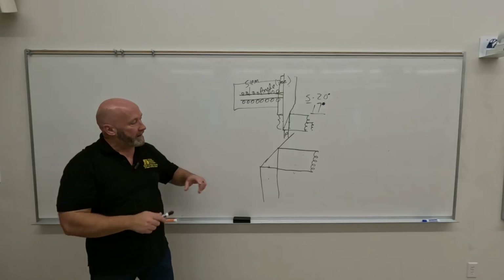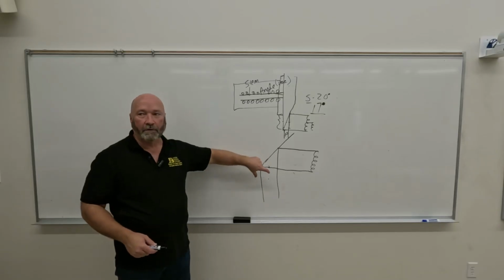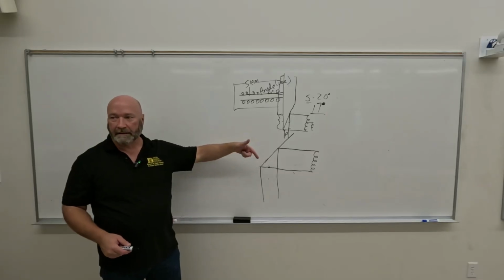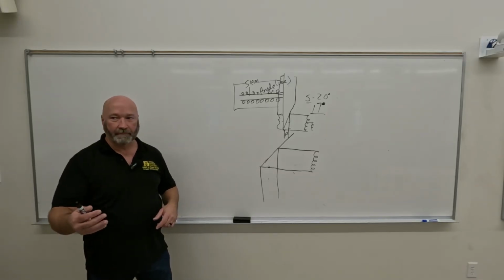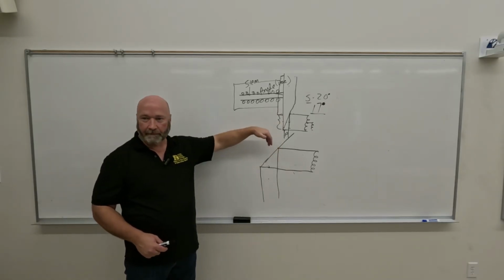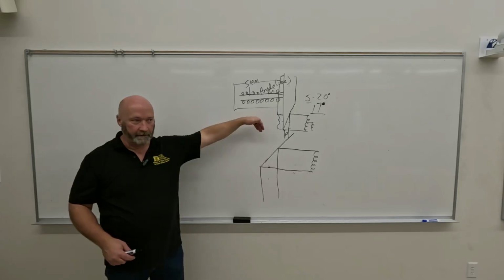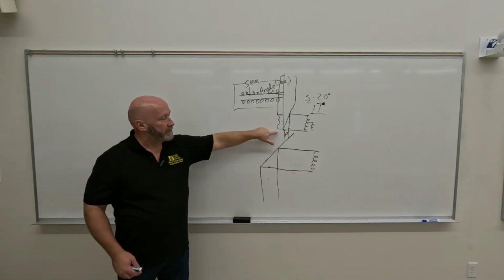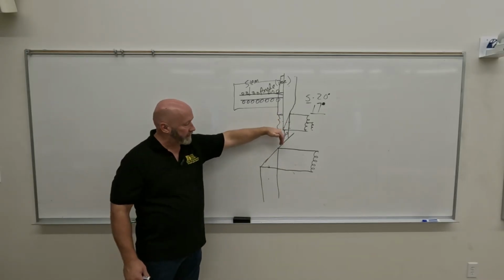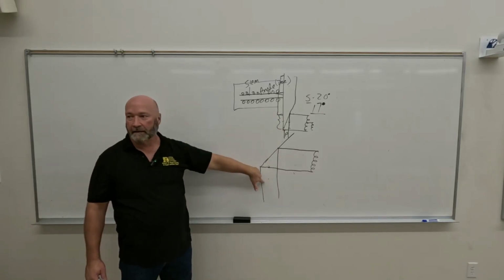Okay. So this stream of photons, and it does, ultimately controls our sharpness or recorded detail. Which one are we going to get better sharpness off of? A nice fine stream of photons, or a big fat stream of photons? Everybody agree to that? The fine one? And you're right. So small focal spot gives us a nice tight stream of photons as opposed to this. So we've got a light bulb compared to a fluorescent light.